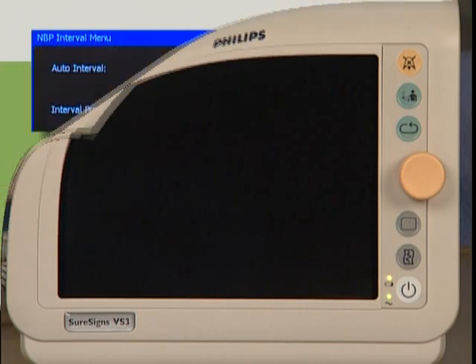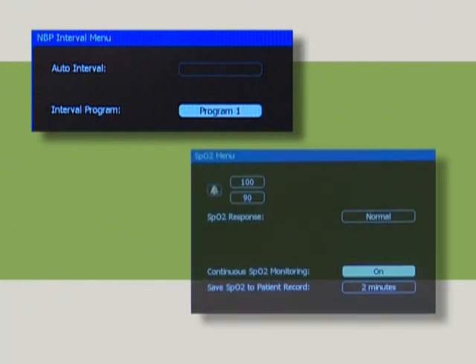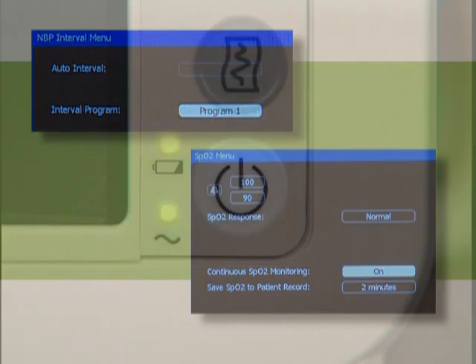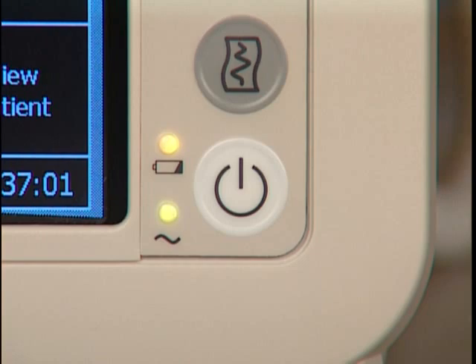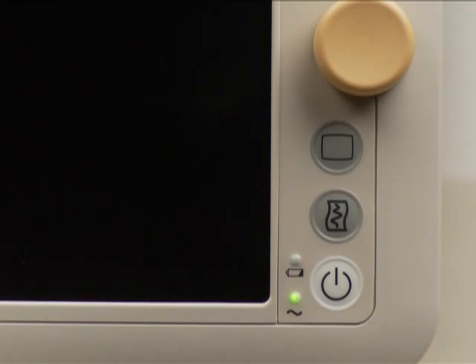In auto-suspend mode the screen goes blank, helping to conserve battery power. The monitor does not go into auto-suspend mode if NBP intervals or continuous SpO2 is enabled. Push the on/standby button to power up the unit and the parameters will become active in approximately 10 seconds. You can enter standby mode manually at any time by briefly pressing the on/standby button.